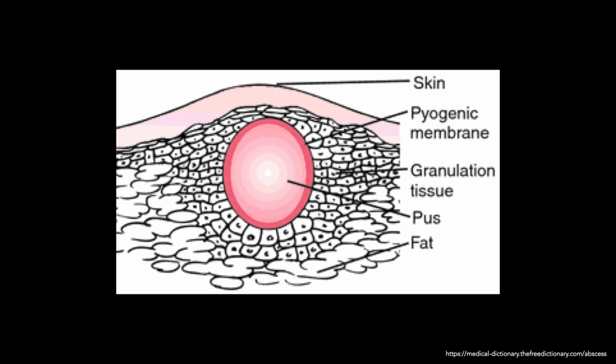So breaking down in the same pattern what's going on from a gross histologic perspective. Obviously, you have your skin. This is an image from the medical dictionary as referenced below. But you basically have your skin and subcutaneous layers, and then underneath that, you have that subcutaneous layer.